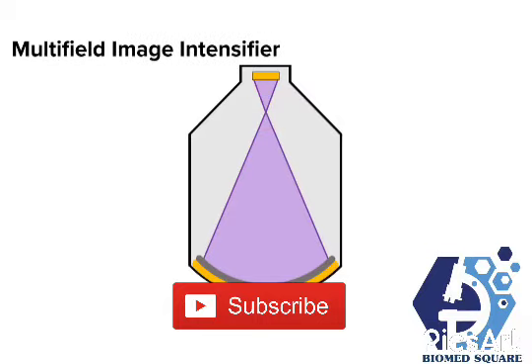A multi-field image intensifier allows you to magnify an image. Magnification can be accomplished by changing the size of the input phosphor. Input phosphors usually come in 12, 17, and 25 centimeter sizes. Let's see what happens when we go from a 25 centimeter input phosphor to a 17 centimeter input phosphor.